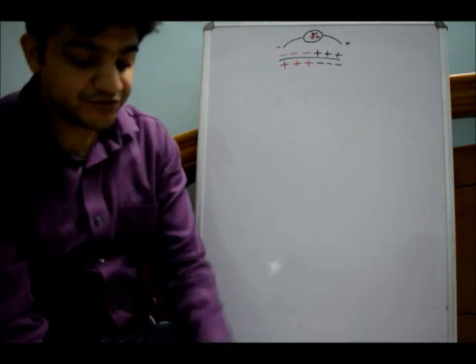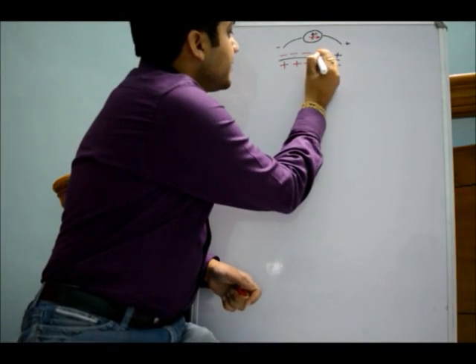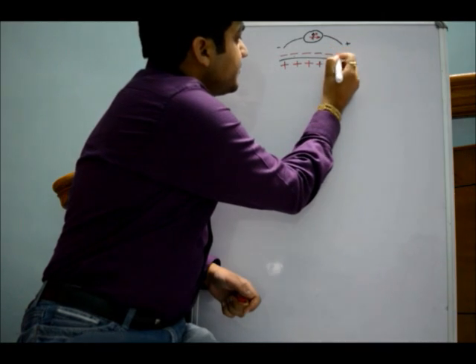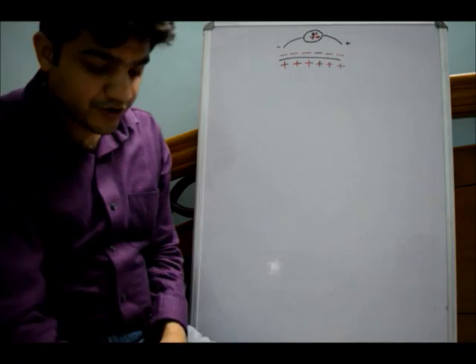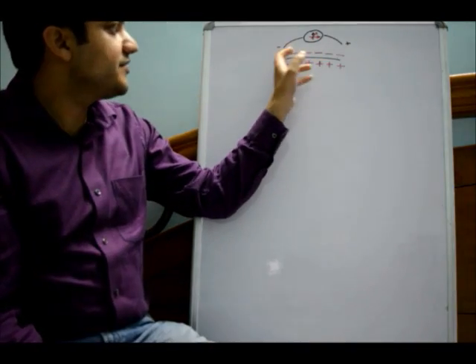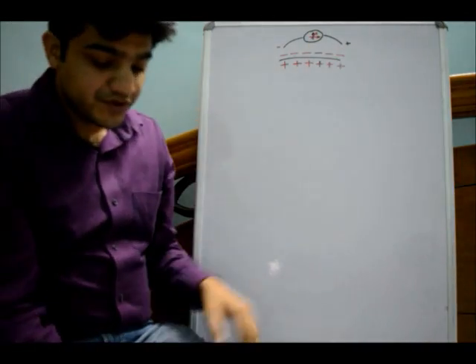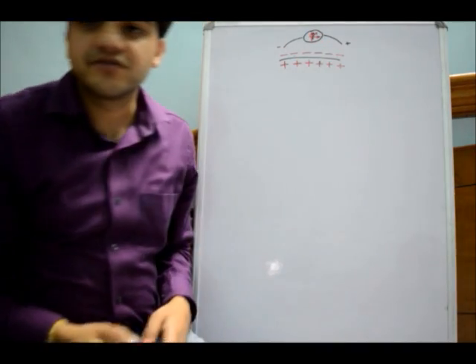And after this, what will happen? If the depolarization goes on further, this region also becomes negative, and it proceeds further till the end. What will happen? All of the myocardium now is in the state of depolarization. So when it is depolarized, these two ends again have the same potential, though on the opposite side, that is negative. So again you will see no deflection in this case.